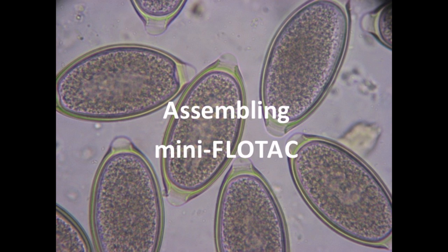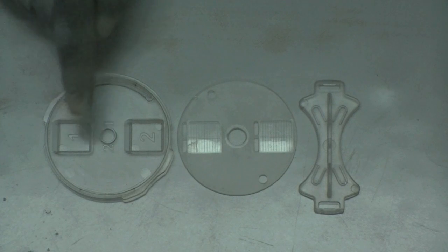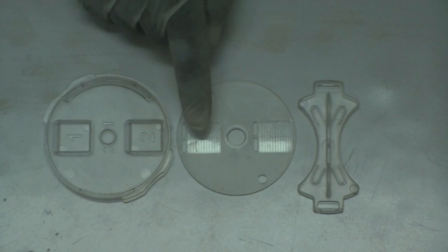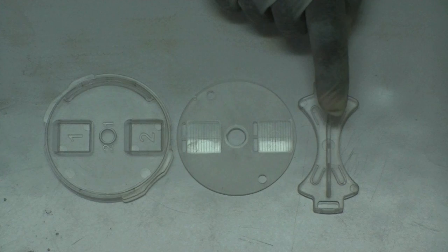Assembling the mini FLOTAC. The mini FLOTAC apparatus first needs to be put together. It consists of three parts: the base with two numbered flotation chambers, the reading disc with two grids, and the key.